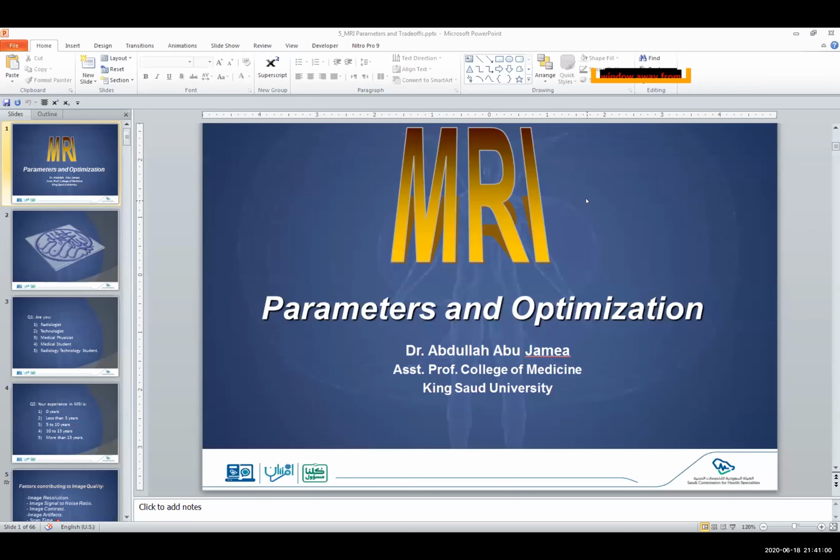The T1 contrast will make the recovery of the blood faster, so instead of showing the blood black, with short recovery, it will show bright, like the blood will become very bright like fat. So it enhances areas where the contrast can pass the blood-brain barrier, and they show bright using a T1 contrast.